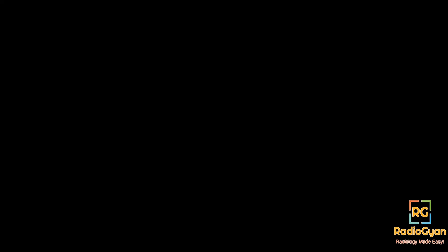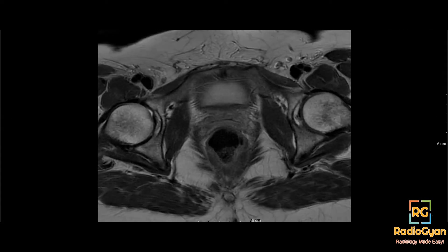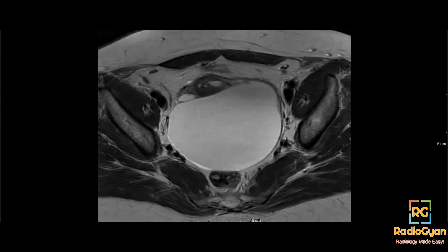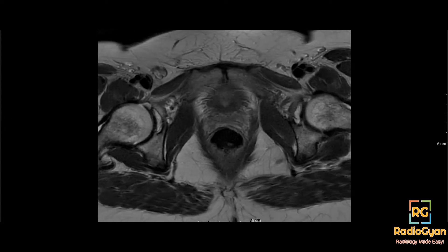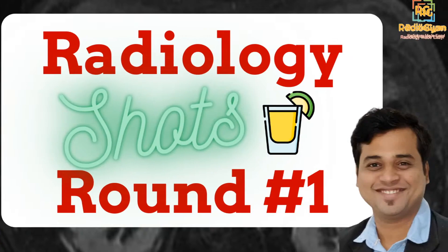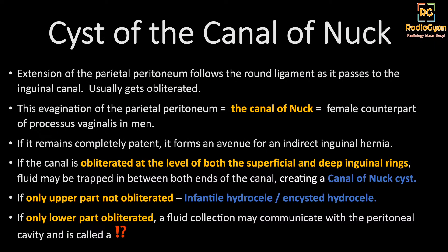I hope everyone has seen the case. To recap: in a breast cancer patient with bilateral cystic adnexal lesions, we found a cystic abnormality in the right inguinal canal. What this was turned out to be a cyst of the canal of Nuck.